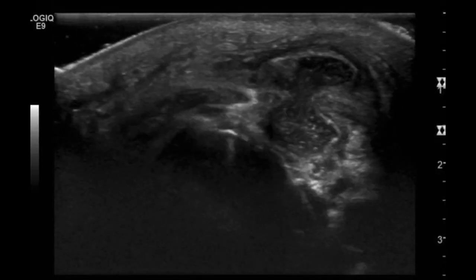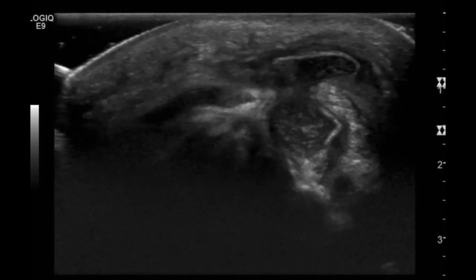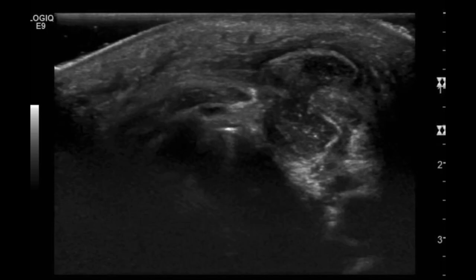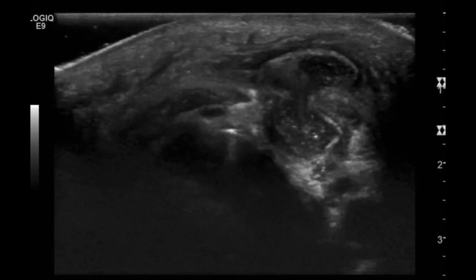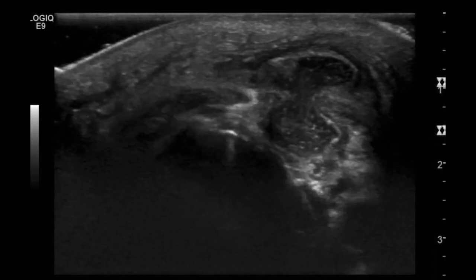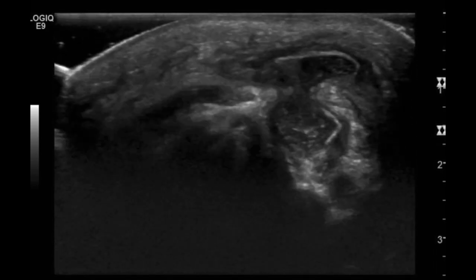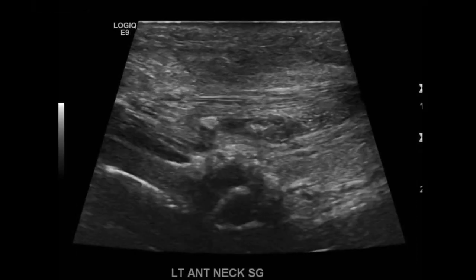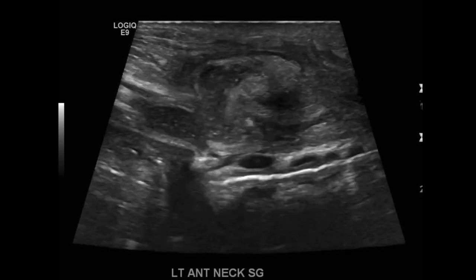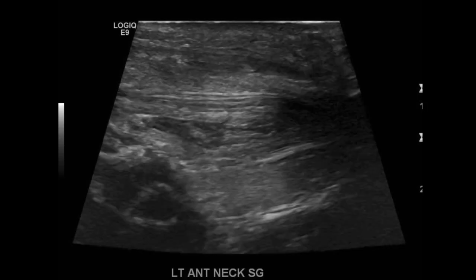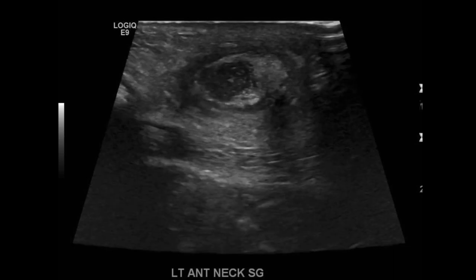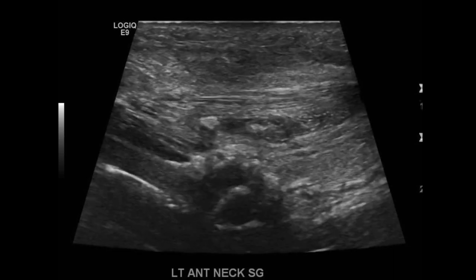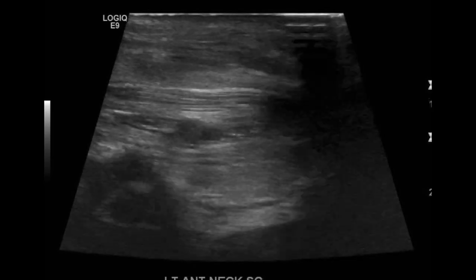Here's another case of a patient who presented with a mass in the submental region, or section one of the neck. You can see that there's internal debris, and as you move the transducer you can see it sloshing around. The soft tissues around this hourglass-shaped cystic lesion were slightly echogenic — you can see some edema, which are signs of inflammation or infection. Here is the same lesion in sagittal. You can see the inflammatory changes in the deeper parts of the cystic structure. There was some concern that this might be some type of atypical branchial cleft cyst or perhaps a lymphatic malformation, but it was confirmed by pathology to be a thyroglossal duct cyst that was infected.